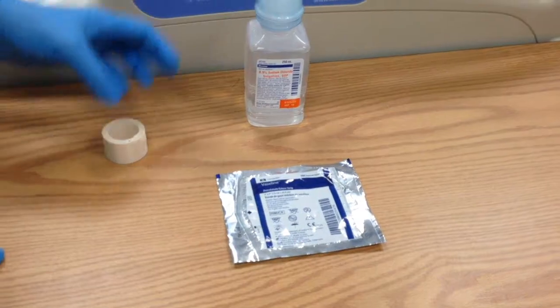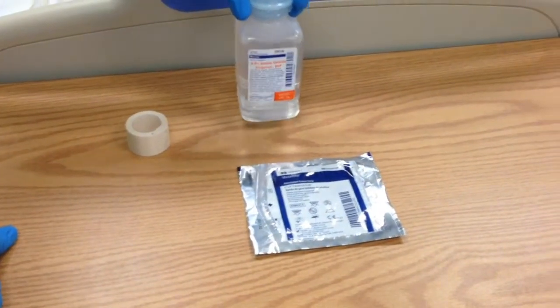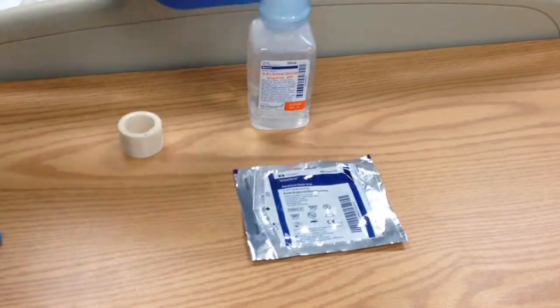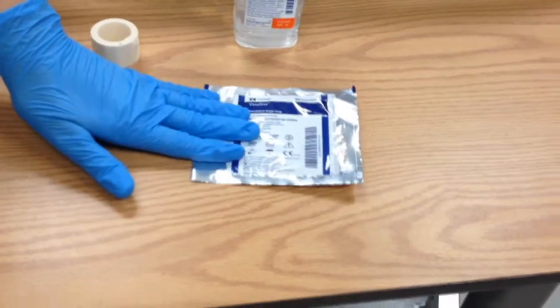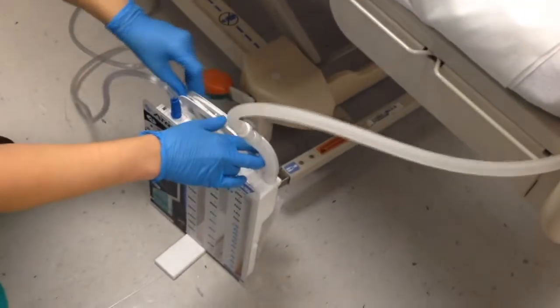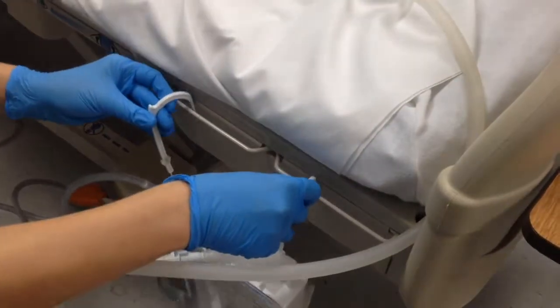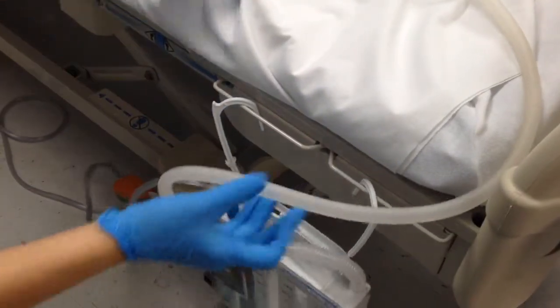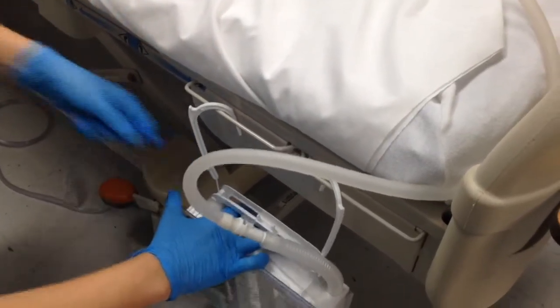At the bedside you want to keep tape in case you need to reinforce the chest tube. You'll want saline in case the chest tube becomes detached or tubing comes loose — submerge it into the saline to keep it sterile. You'll also want vaseline gauze in case the chest tube gets dislodged or falls out, so you can plug the hole. When transporting the patient, pull the hooks up on the drainage unit, hang it low, and do not put it on the bed with the patient. Always keep the drainage level below the patient, then remove the suction and it will run to gravity.